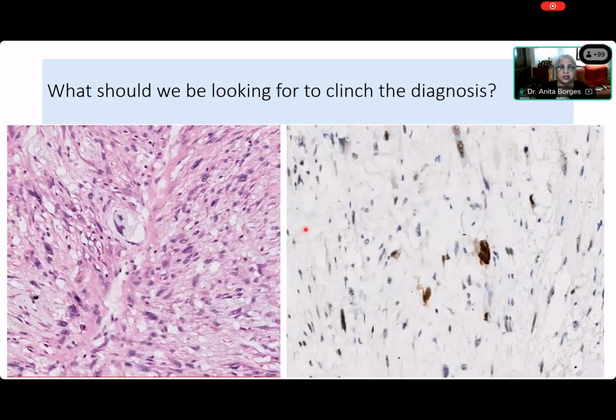What immunohistochemistry is this? Anybody tell me? Who's a third year person now? Yes, let's ask. Who's this? Chandana. Chandana, you're a third year? See, this is the H&E and this is an immunohistochemistry. And lots of people in the chat box are giving you the answer. What immunohistochemistry is this, if I want to prove that this is a dedifferentiated liposarcoma? Have you heard about it, Chandana? Anybody else have heard about it? MDM2? MDM2, yes, this is MDM2. Wonderful.